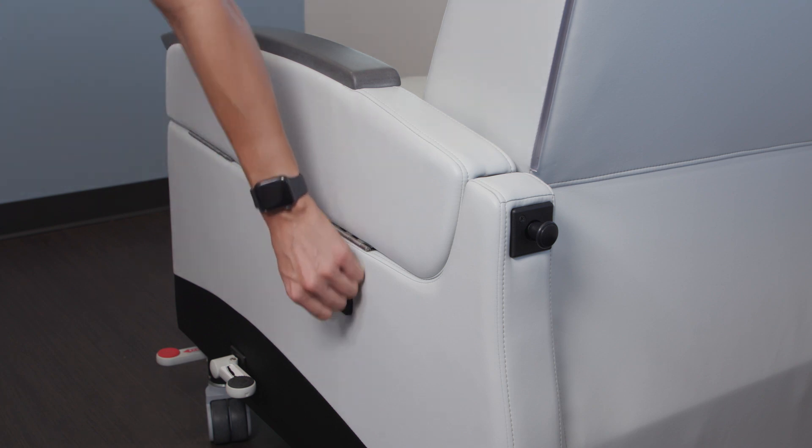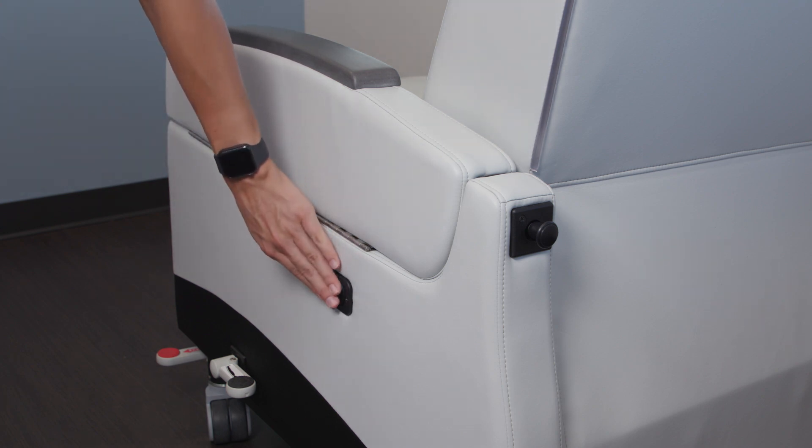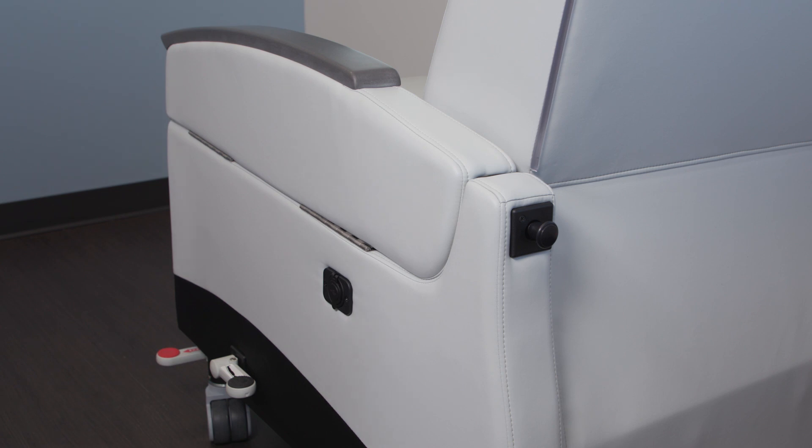Several other options are available, such as USB power shown here, as well as heat massage, IV poles, Foley bag hooks, and many others.